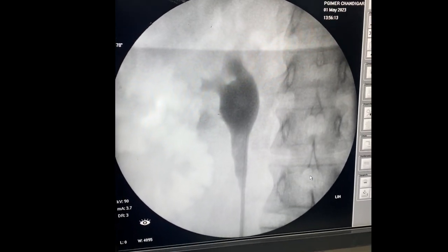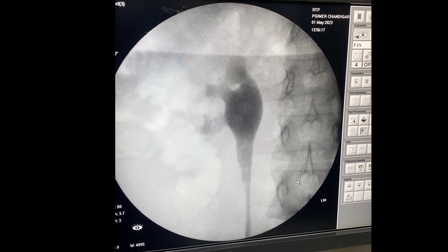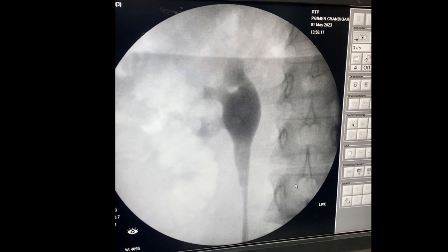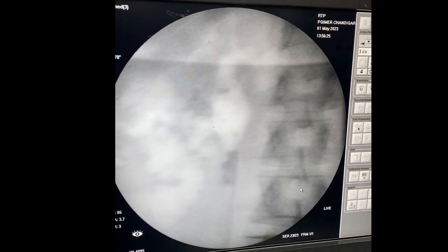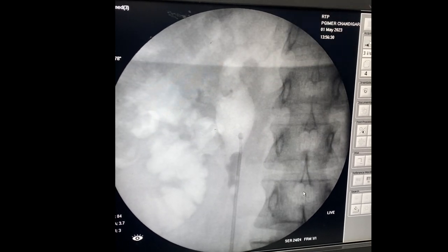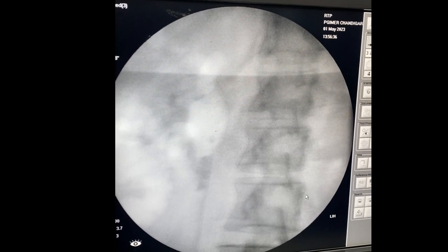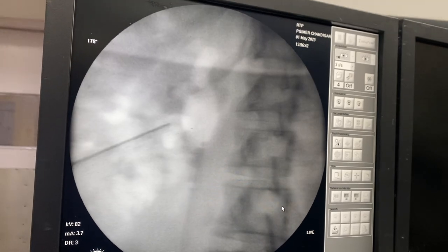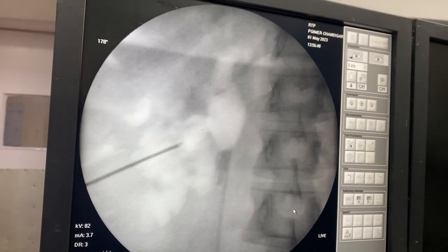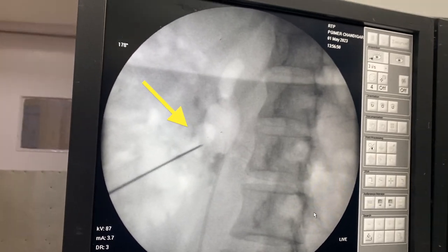After injecting contrast, we always identify the posterior calyx. To identify the posterior calyx, we inject air as you can see in the image now. I am moving the fluoroscopy from 0 to 30 degrees — you can see the calyx I am pointing with the needle. In 0 degrees it is lateral, whereas at 30 degrees the calyx moves medially, confirming it is the posterior calyx.